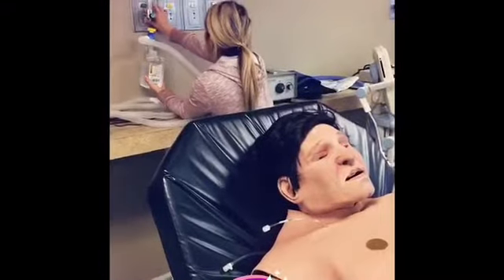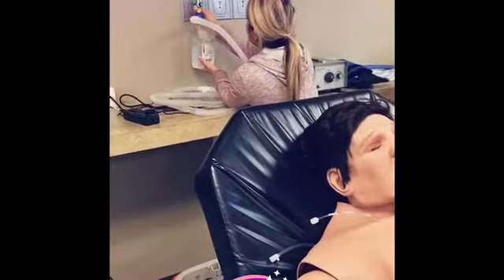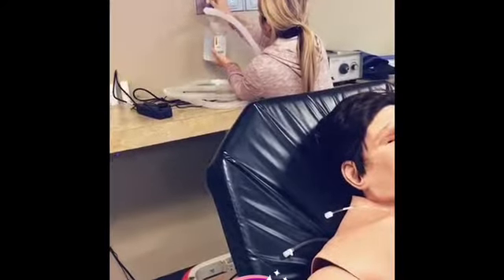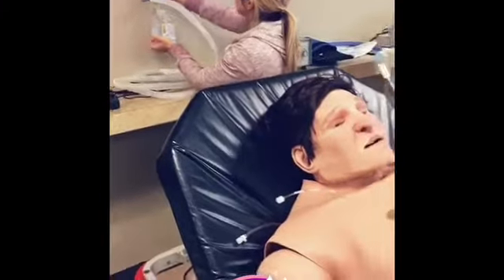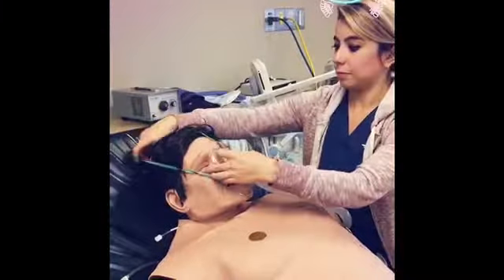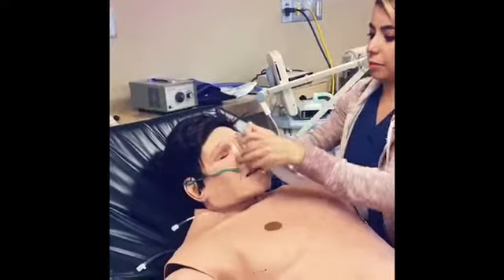Right now, Maggie is setting up a simple mask device. This device is a semi-rigid plastic mask, and the O2 flow rate should be at least 5 liters per minute to prevent rebreathing CO2. A simple mask is usually used for patients who require a moderate flow. It is composed of a plastic mask that fits snugly over the patient's mouth and nose. The mask has holes on each side that are used for exhalation and air entrainment.